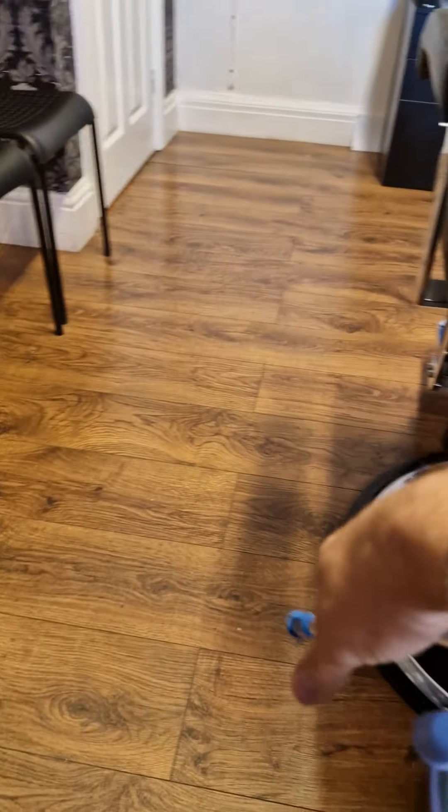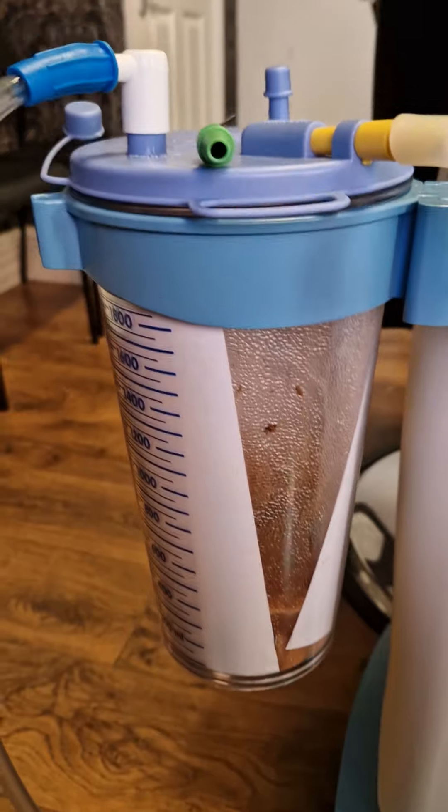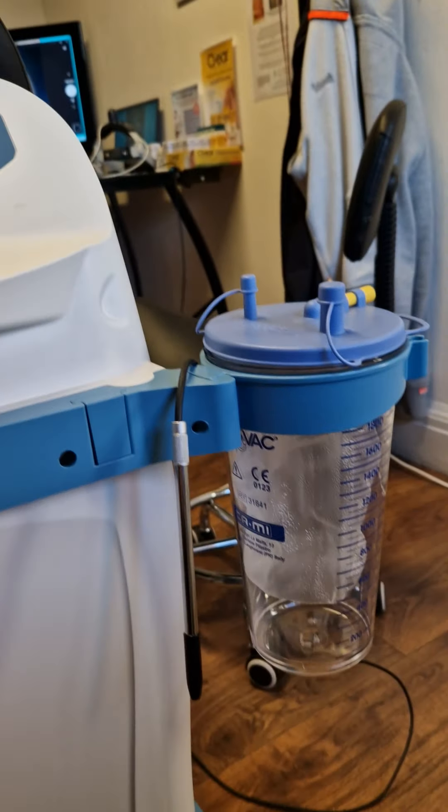The suction unit collects everything into these tanks here. That tank is in use — as you can see there's some lovely stuff at the bottom — and there's a backup for when that one's full.